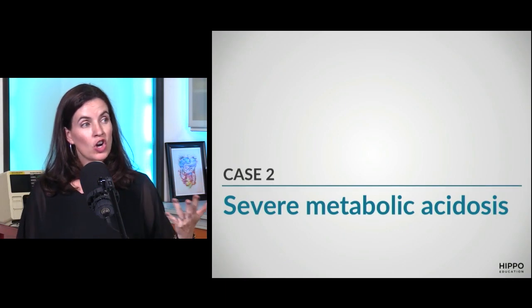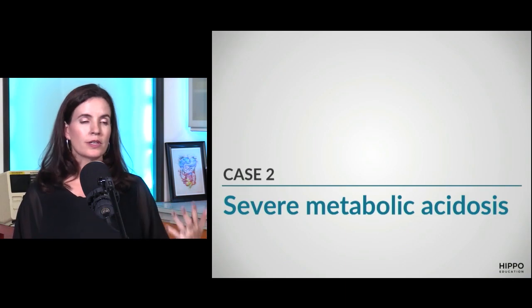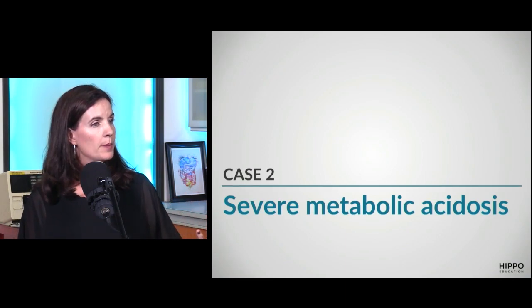And guys, you will have heard people say, you know, don't intubate the DKA patient or don't intubate the aspirin overdose. Why do people say that? Just like case one, clean kills. Clean kills, baby. They have to breathe really, really, really fast to breathe off their CO2, and we're not matching it. Awesome. They're paralyzed. They can't breathe at all. You're right. And then they're no longer compensating. So let's walk through this in a case to make sure it's clear for everybody.